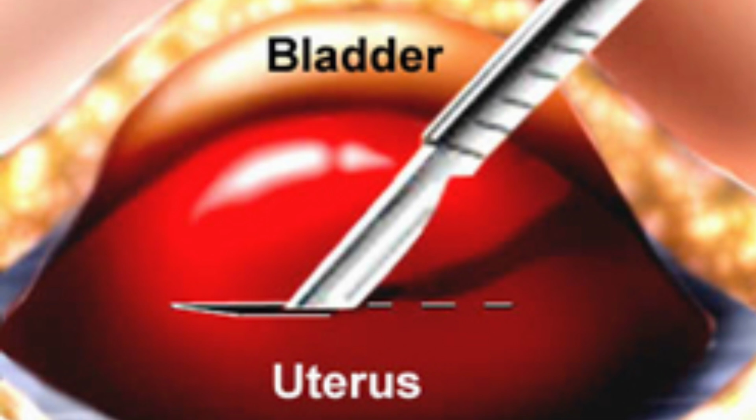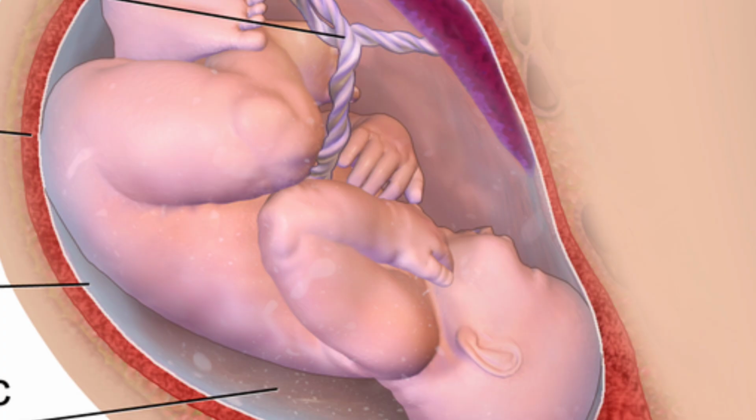Once it's completed, we go to the uterine wall incision. For that, they use a 22 blade or 20 blade to make a small incision. Once they make the small incision, they will extend it. After opening the uterine wall, we see the amniotic sac. How do we open the amniotic sac? With the use of non-tooth forceps or tooth forceps. Some doctors use the curved scissor, some doctors use the blade.